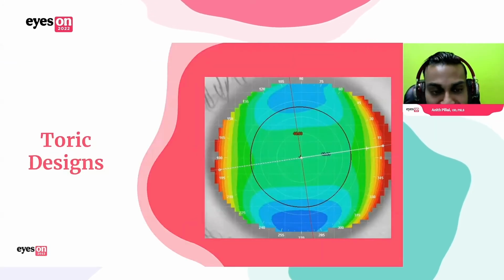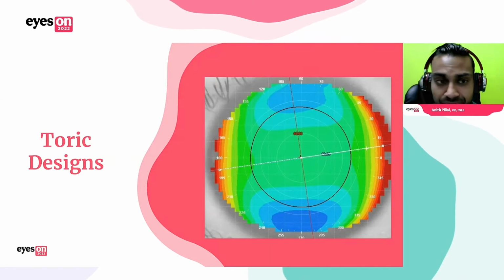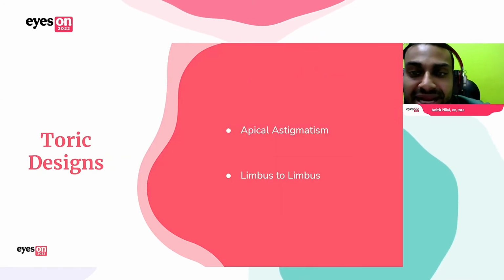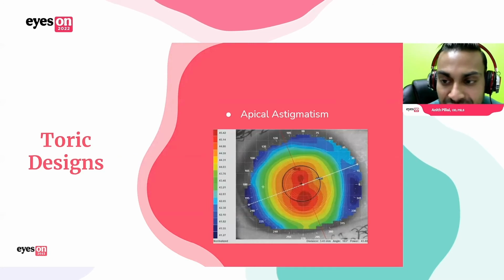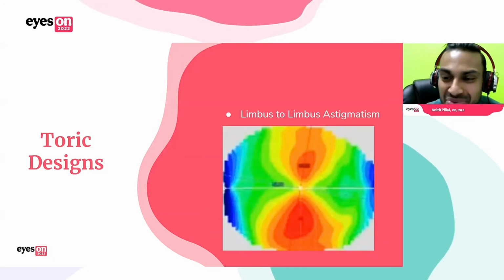For toric designs, I mentioned the way that I determine if I'm going toric is by those elevation maps. And we do need to differentiate apical and limbus to limbus astigmatism. They're very different. So in this cornea, the astigmatism is pretty much central. We can all agree this astigmatism is different. It's extending all the way to the limbus.